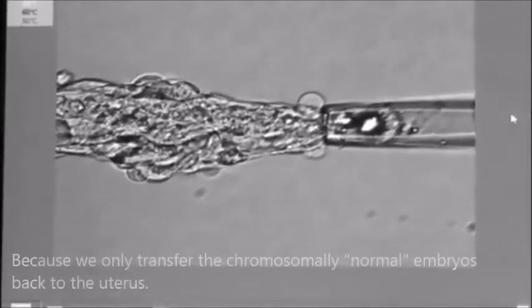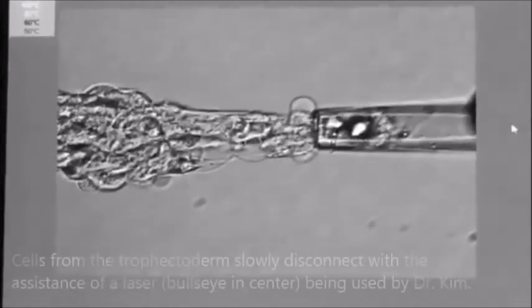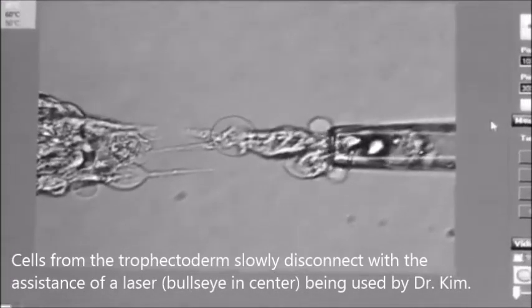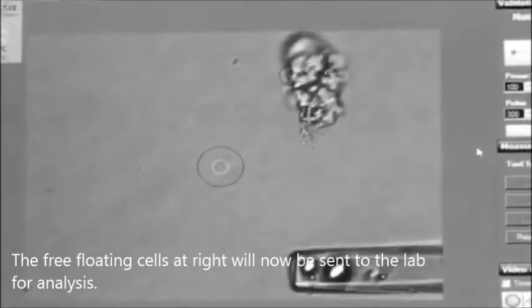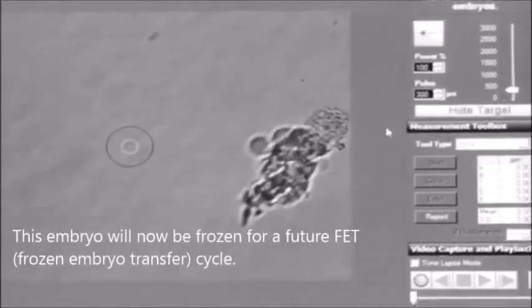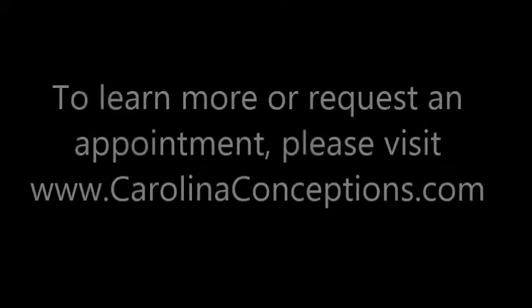The cells are actually slowly coming apart, and he's using a laser — that little bullseye you can see is the laser — to separate them. The cells have been separated and will be sent to the laboratory. Those are the biopsied cells right there; the biopsied embryo is here and will now be frozen.